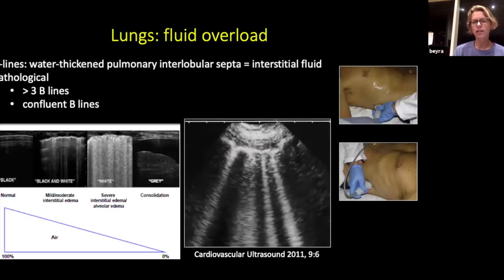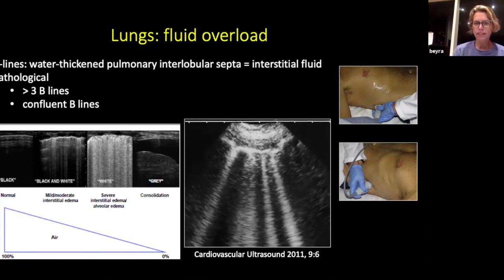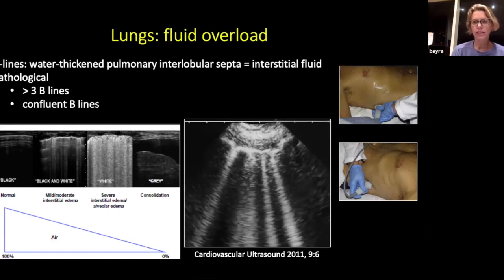You can also slide your probe down to the dependent areas of the lung just below the apex and look at lung water. You'll usually see a very bright line which is the pleura, and from there bright lights coming down - we call them comet tails. Normally there should be about three comet tails on your picture, but as soon as you get more than three or they become confluent, you need to worry about extra lung water. This alerts you to problems with LV contractility - a sign of LV failure.